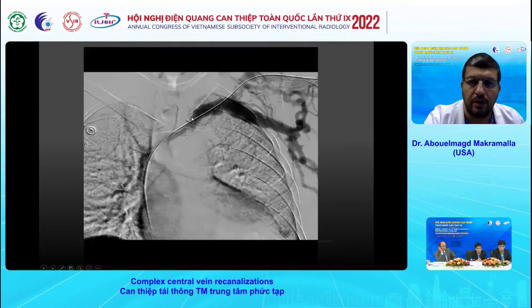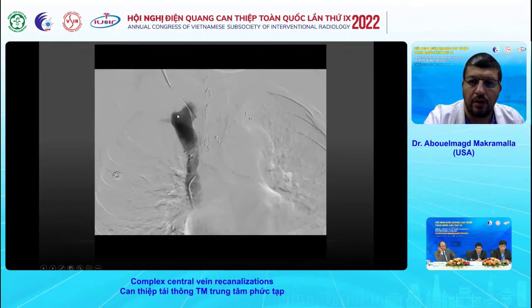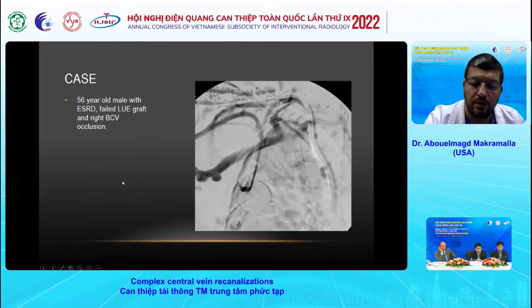And we angioplastied the vein to confirm that we are still within the vein lumen that was occluded, and we placed a covered stent to maintain patency of the left brachiocephalic vein. The right brachiocephalic vein was also patent, was not jailed off. The patient actually had excellent results, and the swelling resolved within a few days after the procedure.